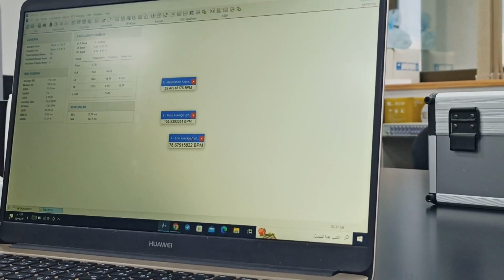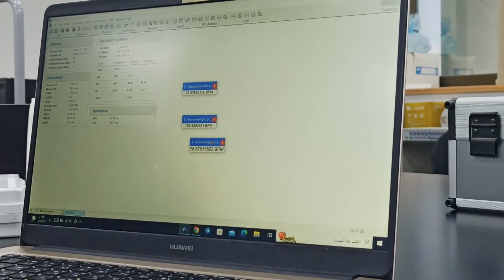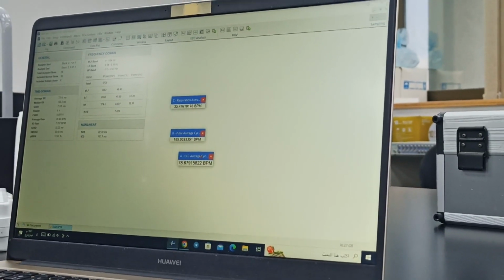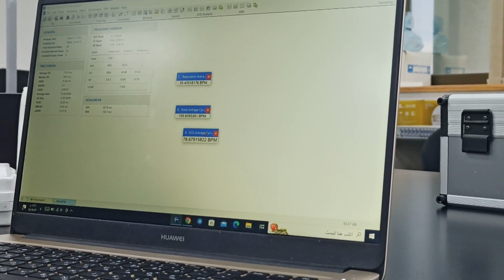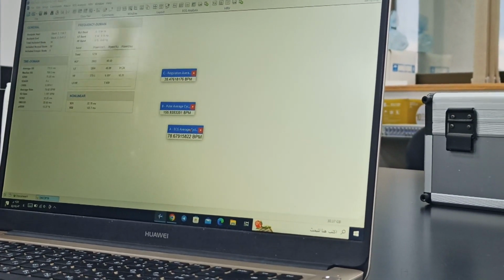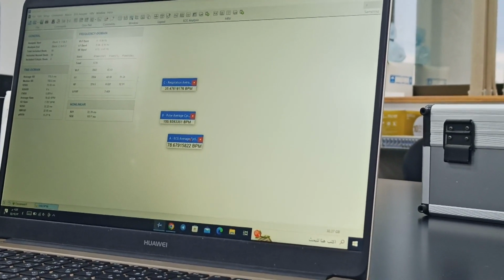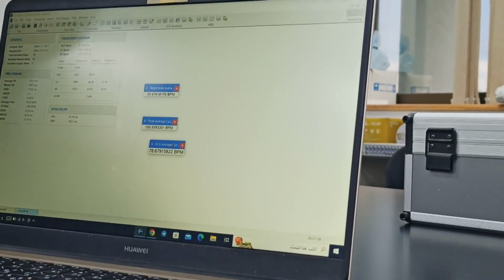What does it mean? Parasympathetic control is very weak when there is no change. Yes, very. So there are no variations. If you are exercising, your heart rate is very high, and there the parasympathetic is almost gone. Only sympathetic is active, so you don't see much variation here. But that is a normal exercise thing. If in a resting condition nothing happens, it means neuropathy, autonomic neuropathy, very frequently seen in diabetes.